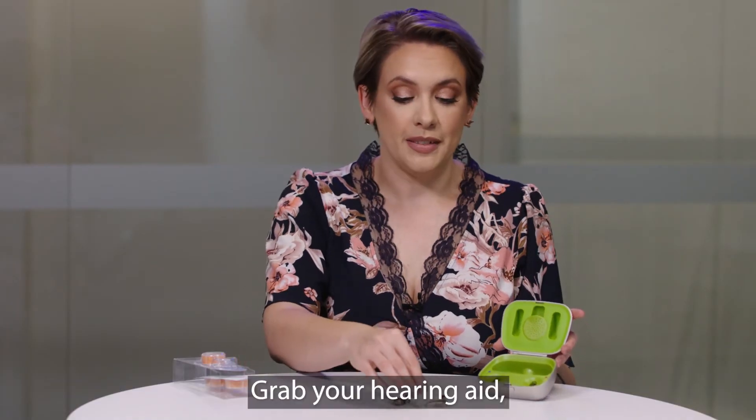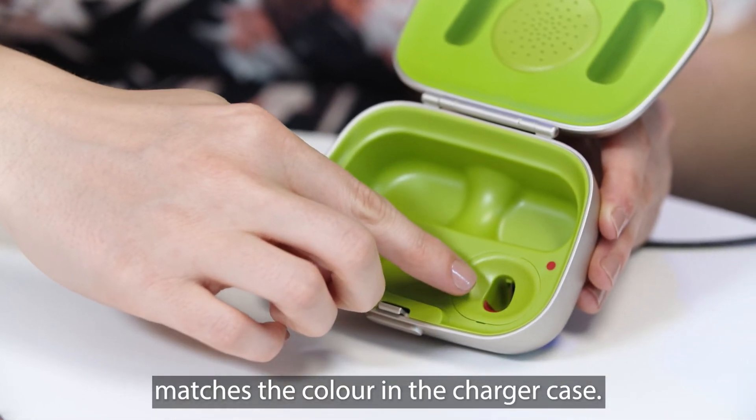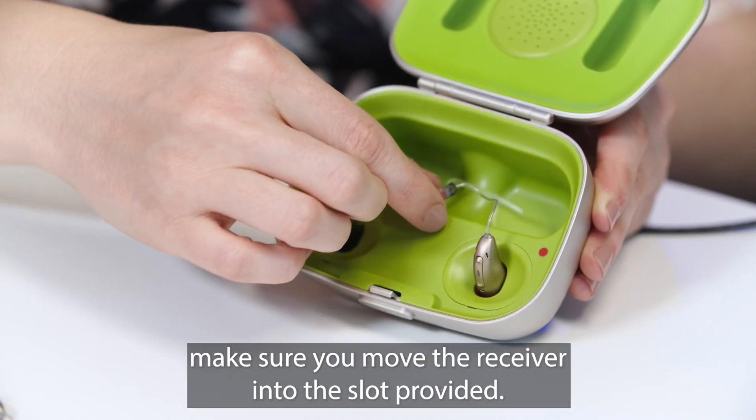Grab your hearing aid. You'll see that the colour on your receiver matches the colour in the charger case. Put the hearing aid into the slot and press down firmly, making sure you move the receiver into the slot provided.